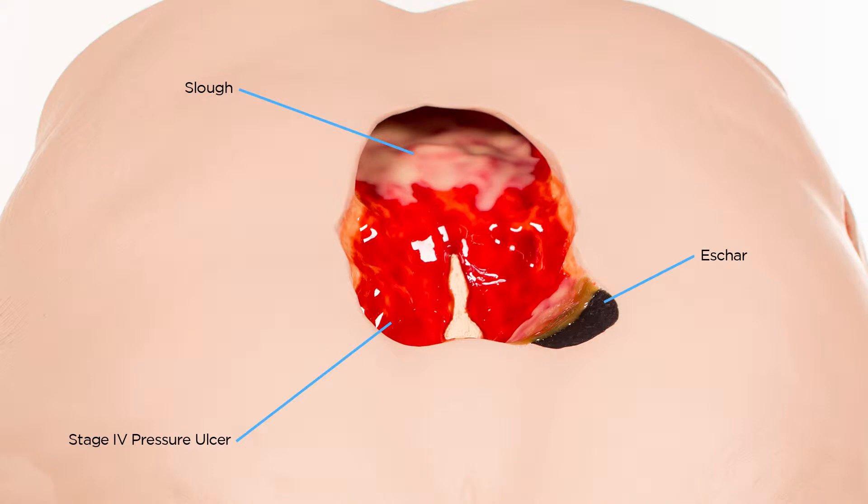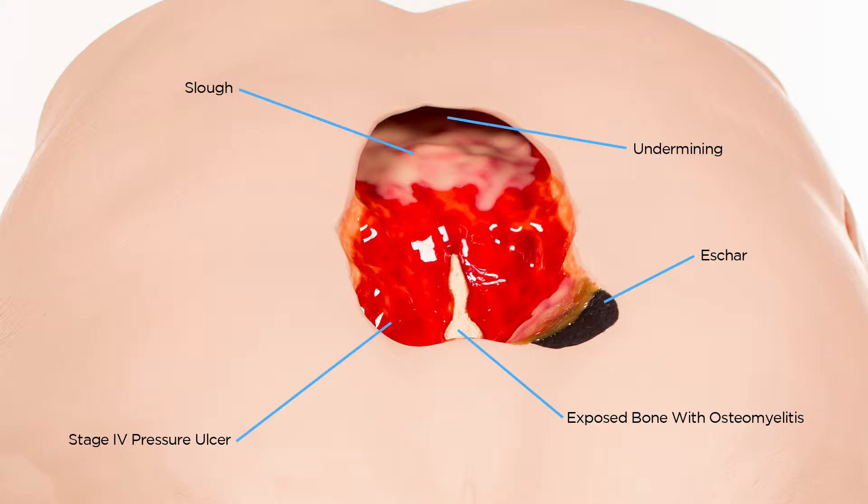In the center of the wound, you can see exposed bone with osteomyelitis. The top of the wound displays significant undermining, and the lower left side of the wound has tunneling.